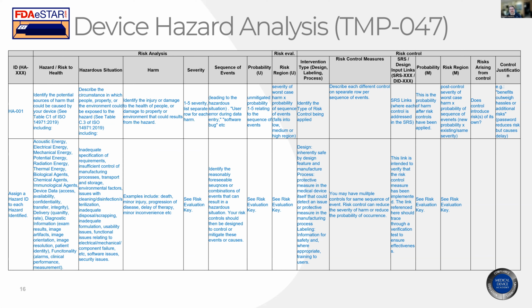Can they actually use that vulnerability to access your system, or do they have to get through physical controls to get to your system, like break open the box? That's a physical control. So depending on what your system is, you might have different things that you're putting in there, but this is one way of documenting it. It's not the only way.